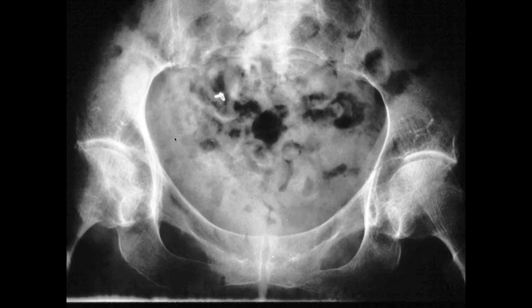Okay, so there is low signal intensity at the inferior aspect of the femoral head, just above the greater trochanter, extending through the femoral neck. It looks like this could be a non-displaced fracture. So this is an incomplete fracture here in the femoral neck. That's right. Okay. Michael. Another patient who came in.